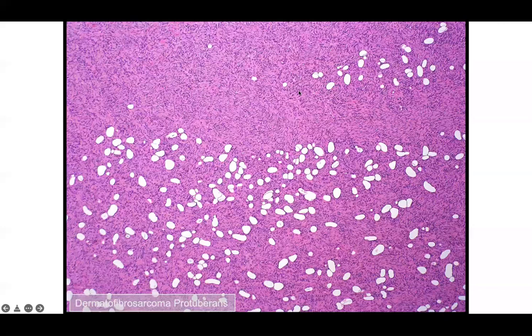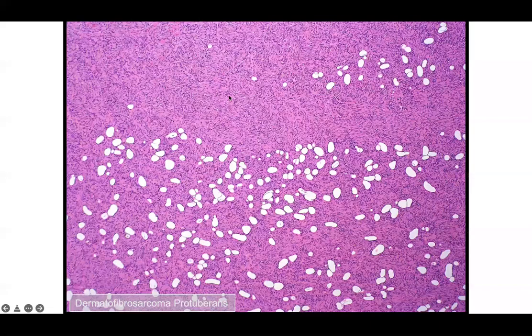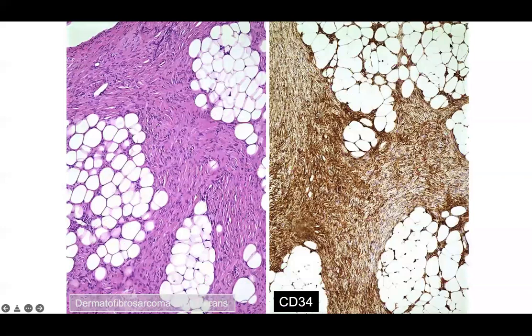Then you do a punch biopsy of this thing and you see it's pretty deep and it flows through the fat, and you're going to say, excise this, make sure the margins are negative for sure. But if you do a biopsy, even just a little piece of this, you should be able to stain it and get very dense CD34 throughout the neoplasm. So you see here, there's no question the CD34 is diffusely and intensely positive throughout this neoplasm.